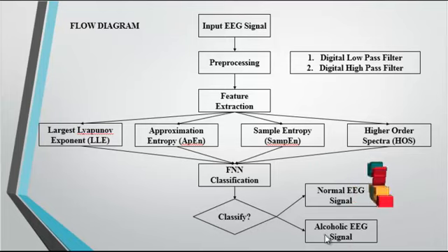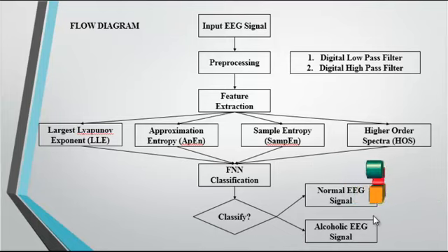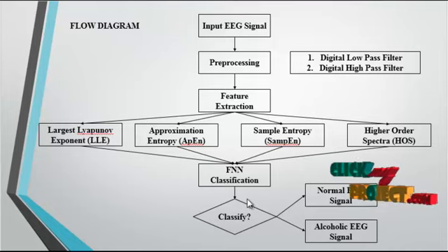After the classification, the performance is estimated. Hence, the process is more reliable and efficient by using the classification and the efficient feature extraction.